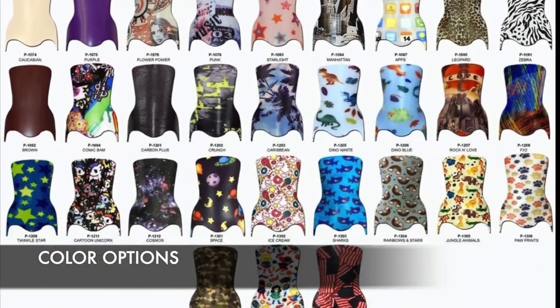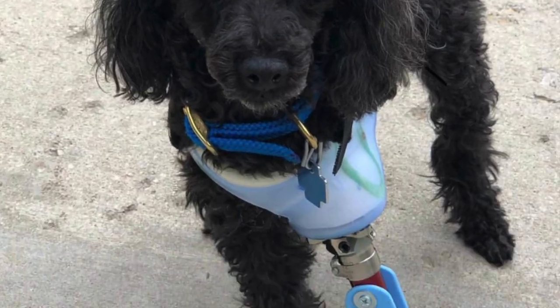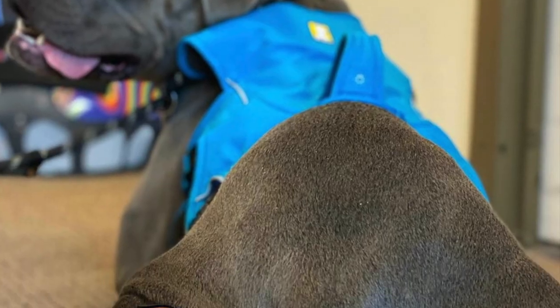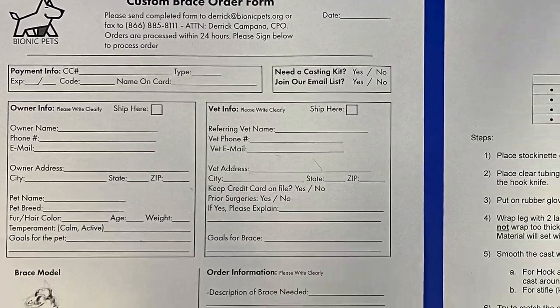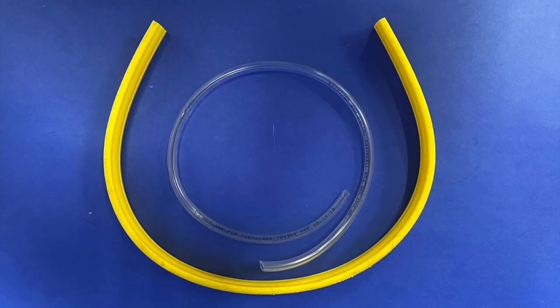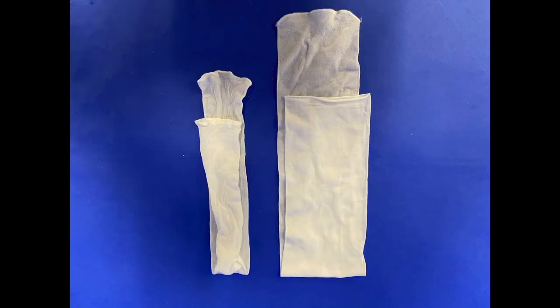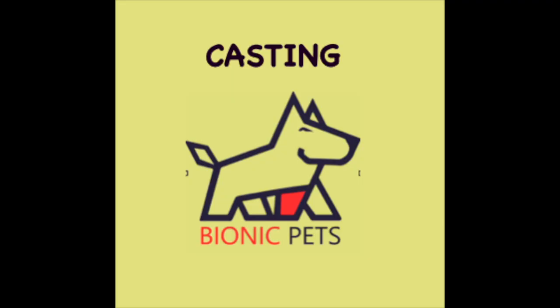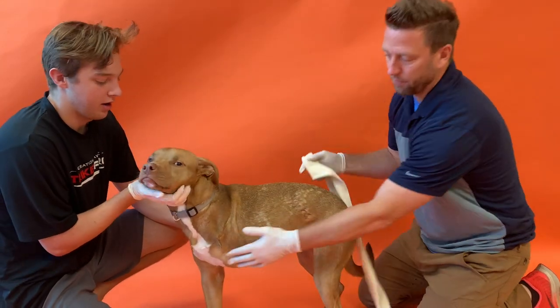Bionic Pets offers a wide variety of colors for your custom device — please indicate your color choice on the order form. The materials included in your casting kit are as follows: an order form, casting instructions, fiberglass casting tape, a cut strip, a pair of gloves, and a stockinette.